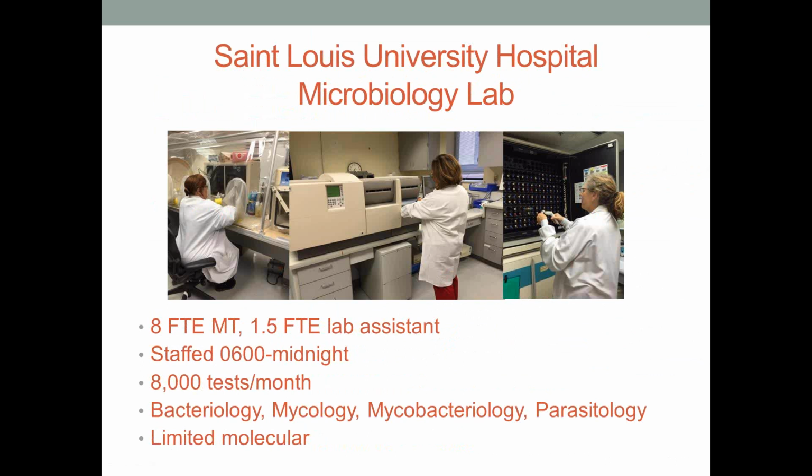The testing that we've chosen to bring into our hospital microbiology lab is really determined by how quickly those results are needed versus can they be batched and performed in the molecular lab, on the complexity and need for things like extraction or sample processing, and on whether there are FDA-approved tests available. So the tests that we've chosen to bring into the hospital microlab at this point are C. difficile testing, rapid identification from positive blood cultures, and respiratory viral testing.